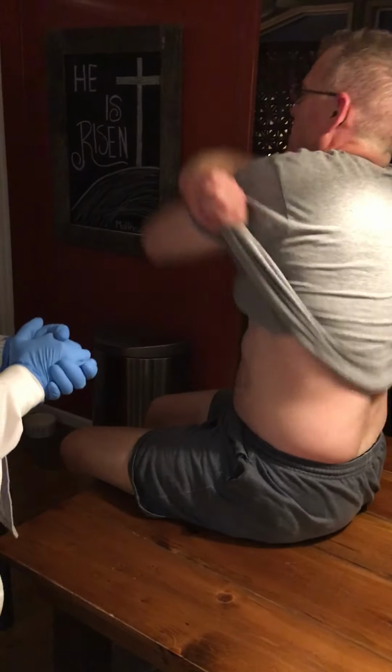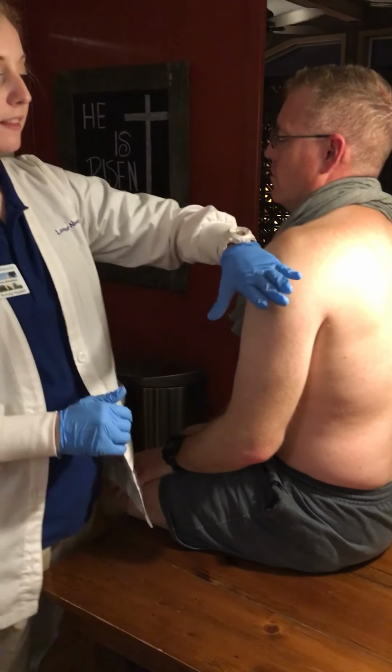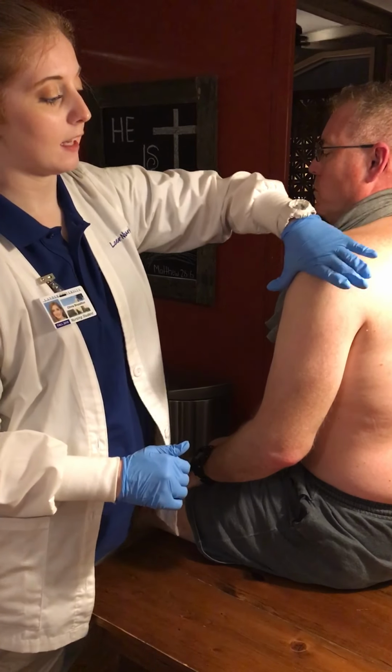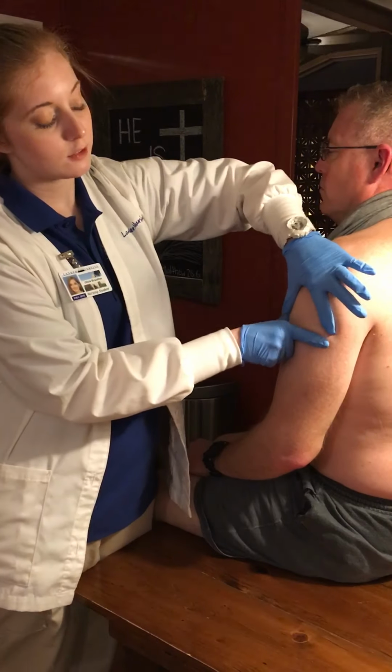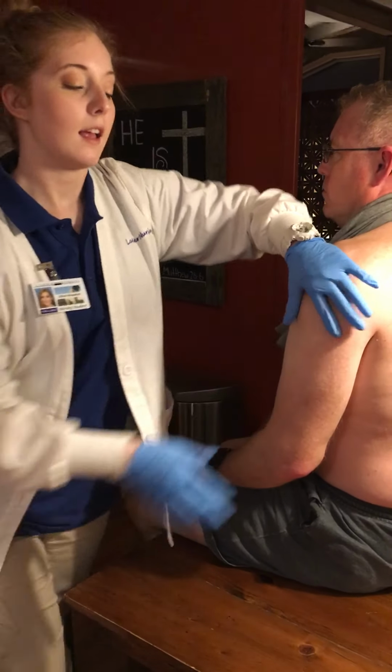So you see that? Just really short. Okay, so I'm going to place my hand at the edge of the acromion process, and I'm going to make it a triangle. So the injection site is within this area.